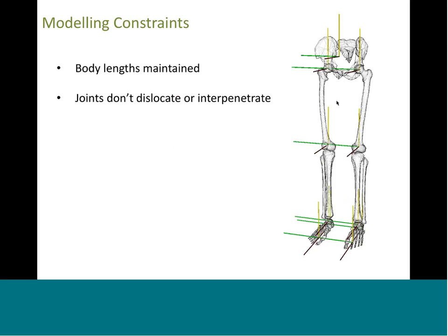Similar to how models in OpenSim constrain translational movement, the models in OpenSim use physiologically defined constraints on the rotational joints connecting adjacent bodies, which limit our rotations to realistic movements.